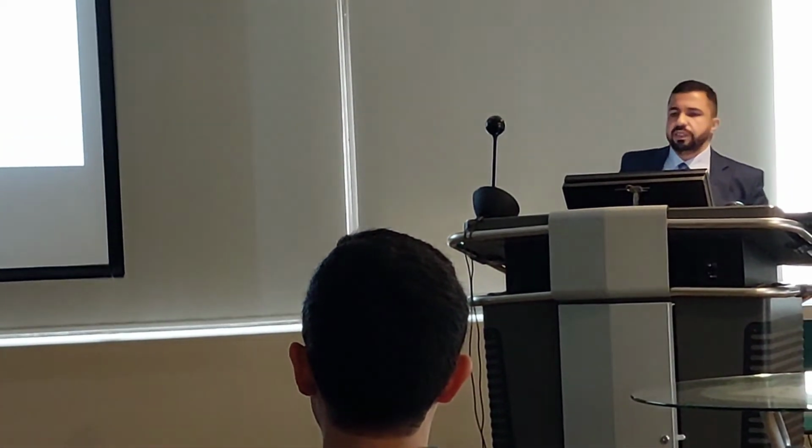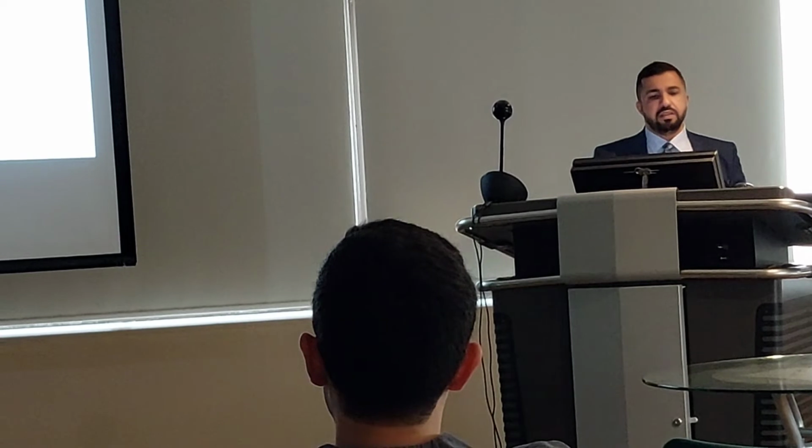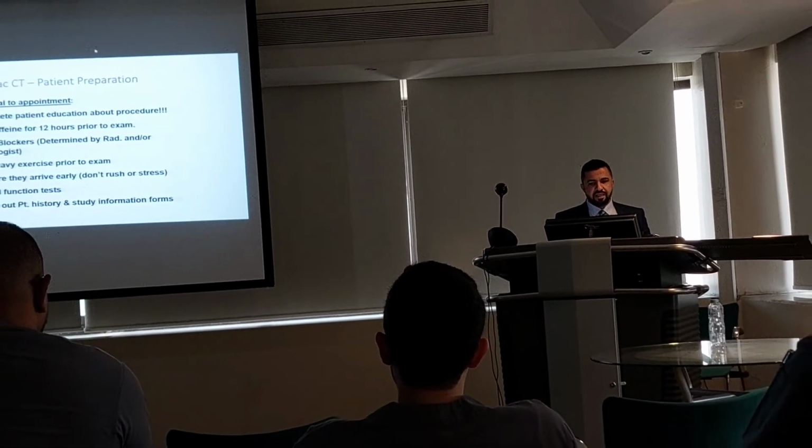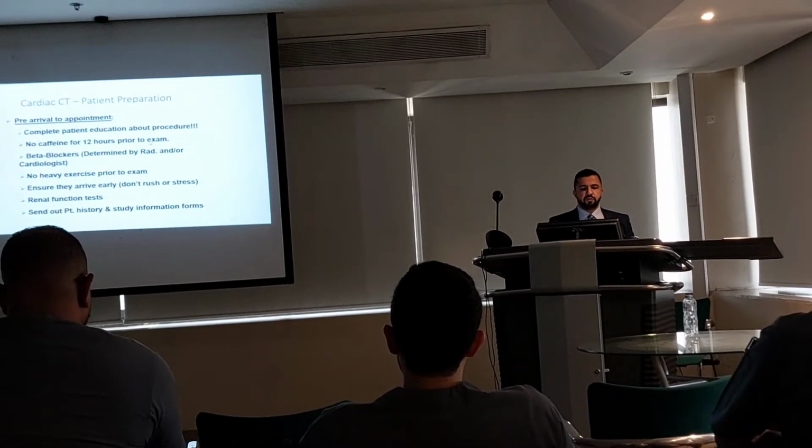Pre-arrival to appointment. Complete patient education about the procedure. So this is the moment when they are, even before, this is the patient preparation. No caffeine for 12 hours.